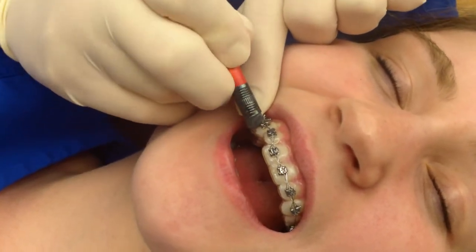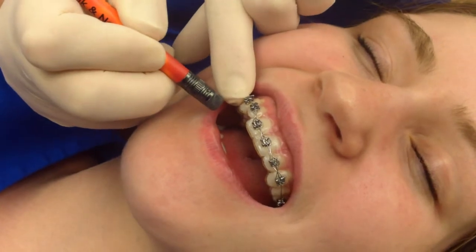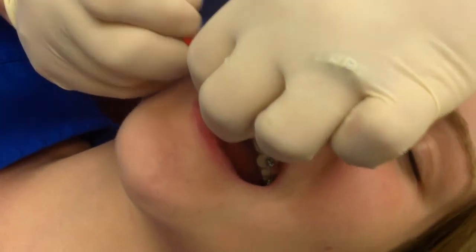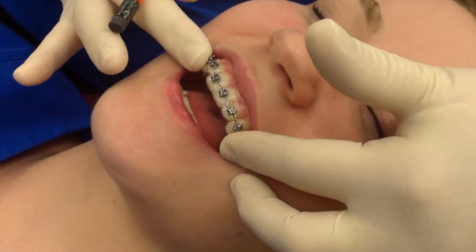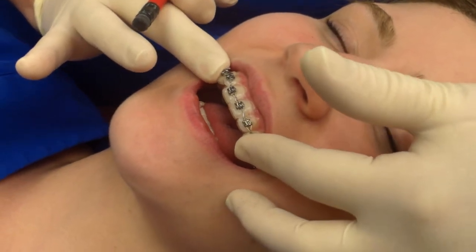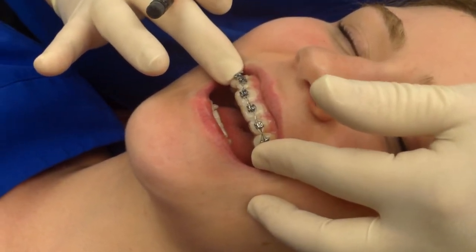And there you go. You can even use your nail a little bit to bend it in. And then on my patient it's nice and smooth. So that's just a little orthodontic trick for home remedy care of a wire that's poking out. Thanks!